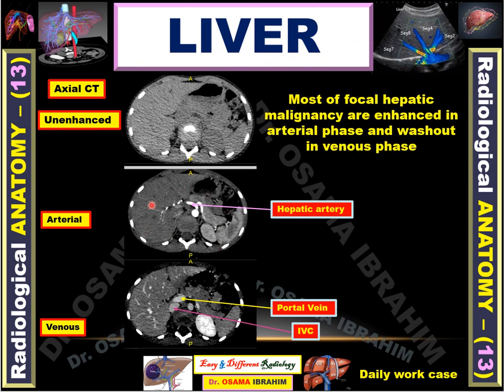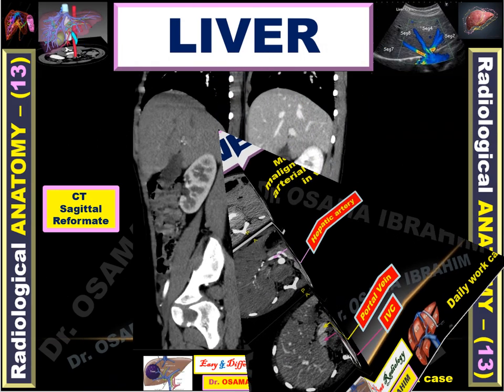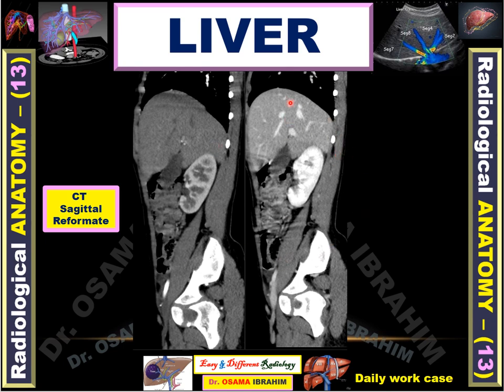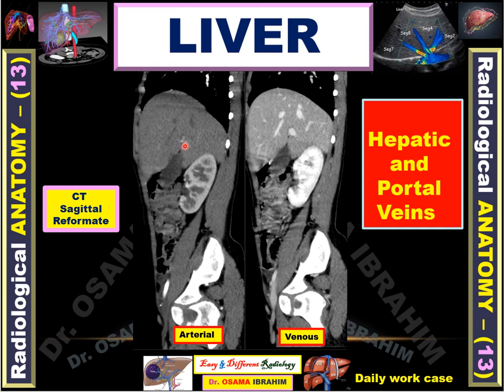The arterial phase can also be used to diagnose malignant hepatic lesions, as most focal hepatic malignancies enhance in that phase and wash out in the venous phase. In this sagittal view showing the liver in the arterial phase, the cortex of the kidney is opacified and differentiated from the medulla. In the nephrogenic phase, both cortex and medulla are opacified. Hepatic and portal veins can only be visualized in the venous phase, while in the arterial phase they appear non-opacified.